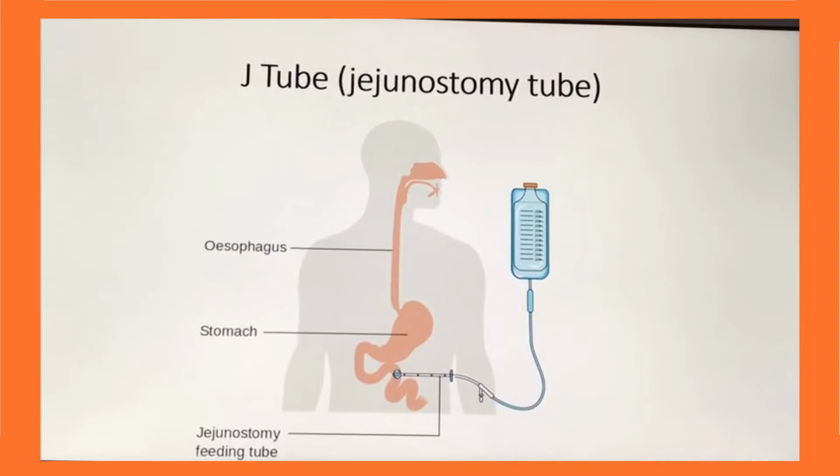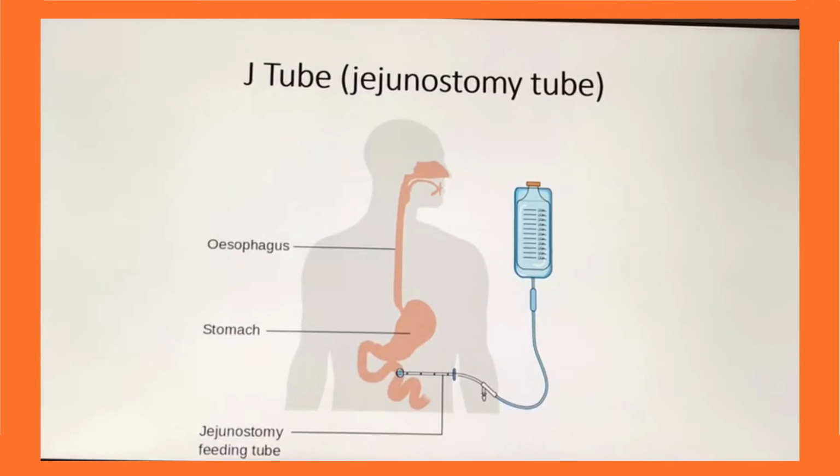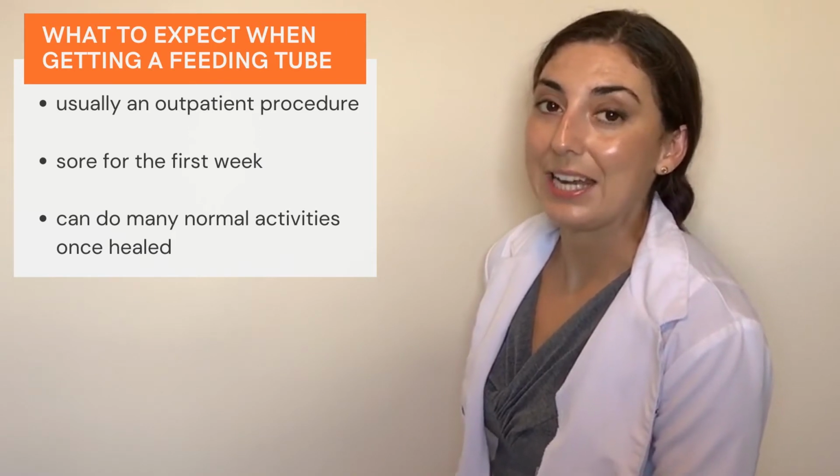And no, that's not a joke. Some people have actually had theirs removed from surgery for various reasons. But as far as head and neck cancer treatment goes, the most often used tube is the PEG tube. We're going to focus on PEG tubes because that's what my patients usually end up getting for their head and neck cancer treatment.